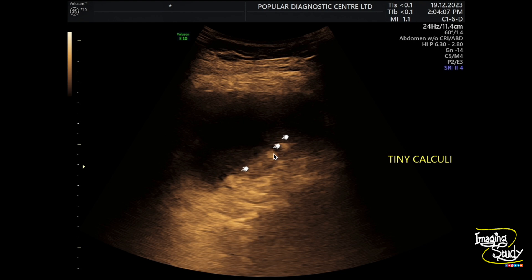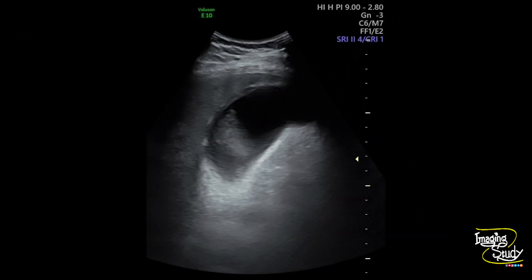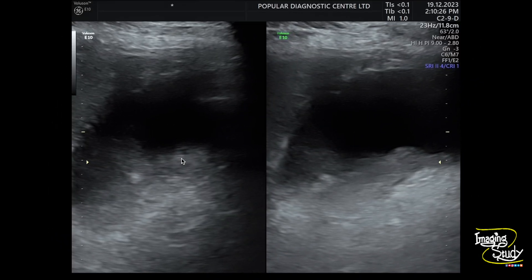Here is another picture of the tiny calculi within the sludge. Here is another picture of the gallbladder showing the thickening of the gallbladder wall with internal sludge and pus. These pictures with high-frequency ultrasound show hypoechoic sludge, pus, and the tiny calculi.